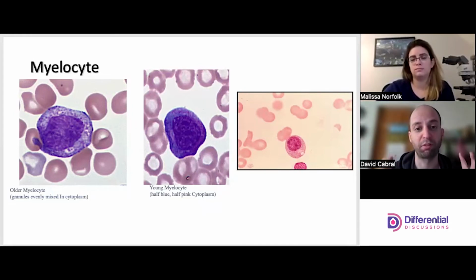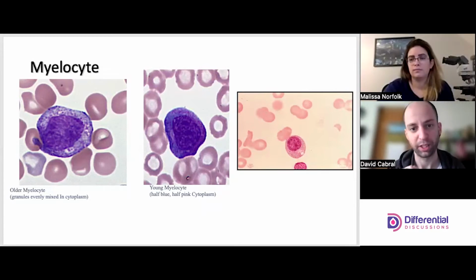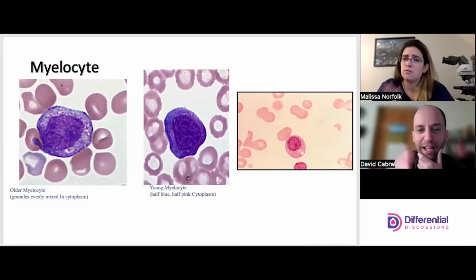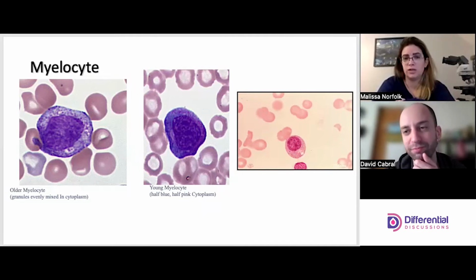Yep. The chromatin now, you're going to start to see clumping is much more apparent. As the cell has made the stuff it needs, the DNA is used less and less, so it starts to get packaged away. There's no nucleoli. You might see a remnant of a nucleolus, which is generally washed out looking compared to what nucleoli usually look like.